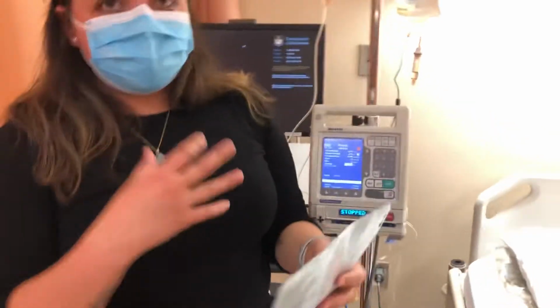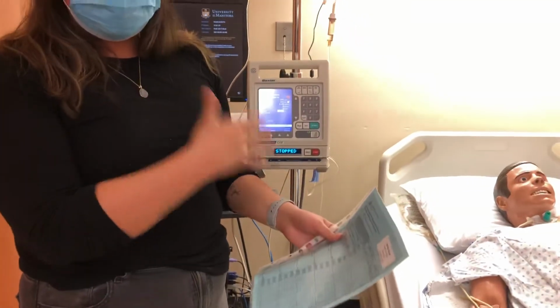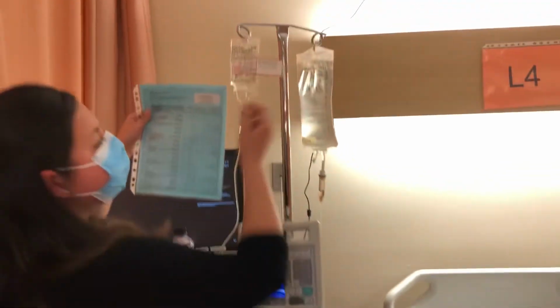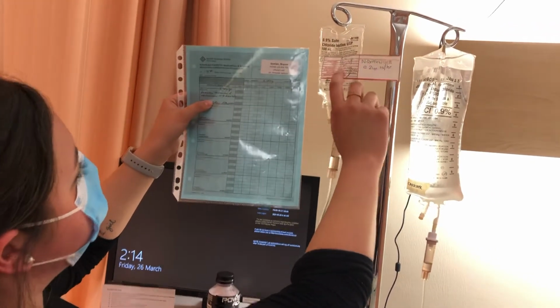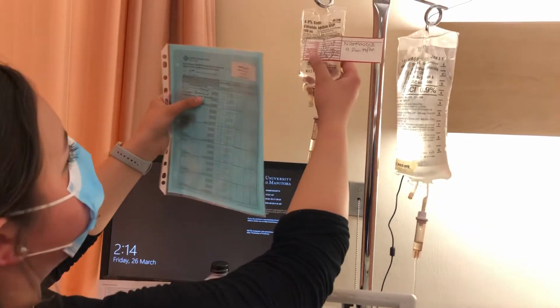At this point, I realized that I have missed my 3rd check, so I would backtrack and complete my 3rd check as I'm going to do now. So I've confirmed that this is Bryson, Scotland, and I've confirmed with the patient. So here with my mini bag, we have Bryson, Scotland. This is Insulin R. Insulin R is to be given continuous IV. This is going to be continuous IV through that Y site. This is at 2 units an hour.